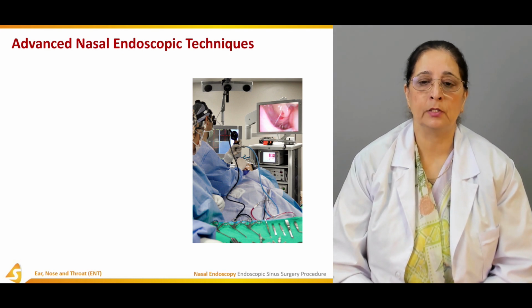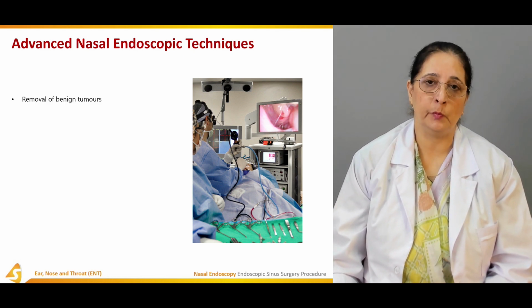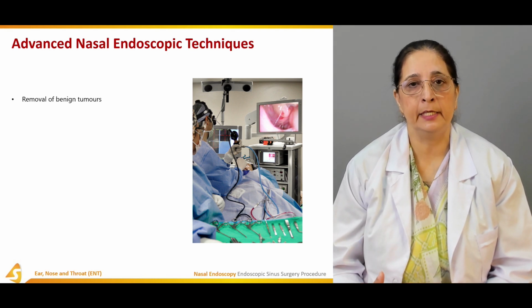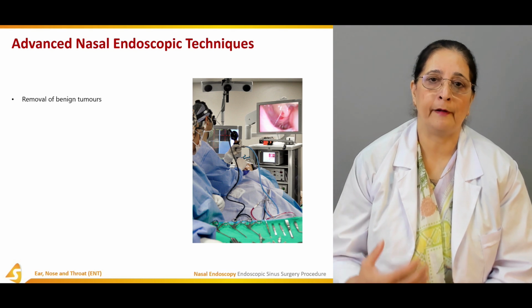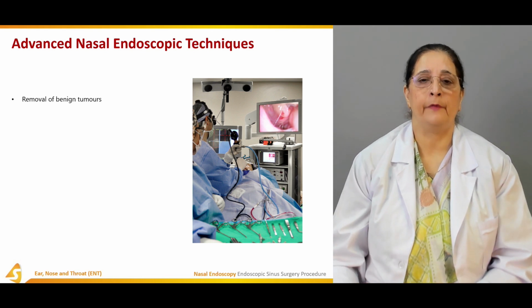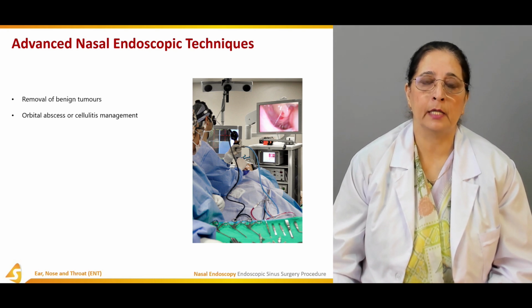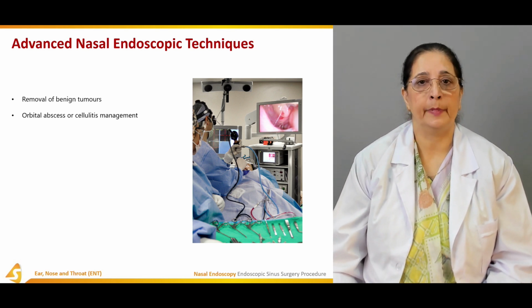Advanced nasal endoscopic techniques. Removal of benign tumors. In advanced nasal endoscopic techniques, we can use this technique even to remove the benign tumors present in the nasopharynx, paranasal sinuses, and the oropharynx also. Orbital cellulitis or orbital abscess management can also be performed by the endoscopic techniques.